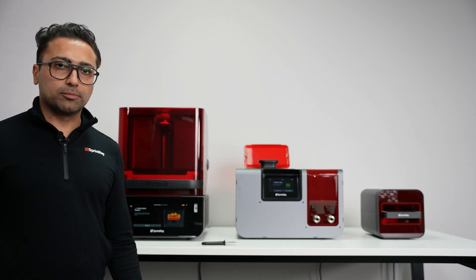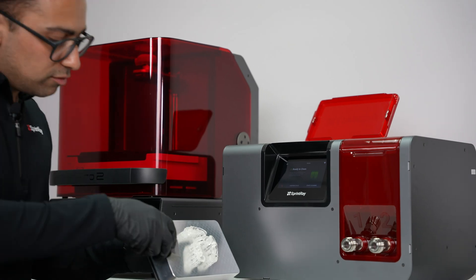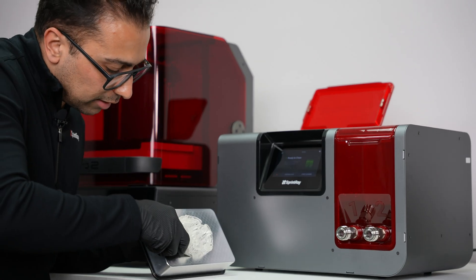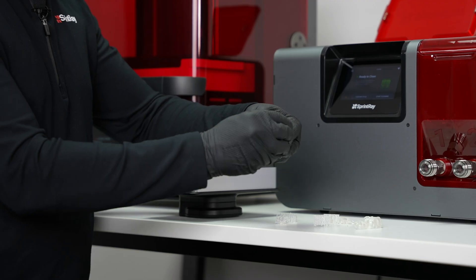Once the wash is completed, simply remove the platform and, using the scraper provided, remove the printed models from the build platform. Then remove the support structure.